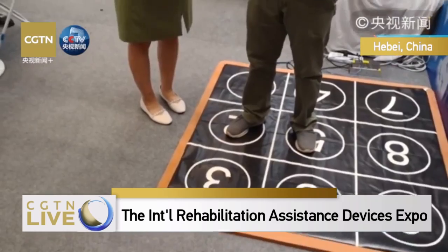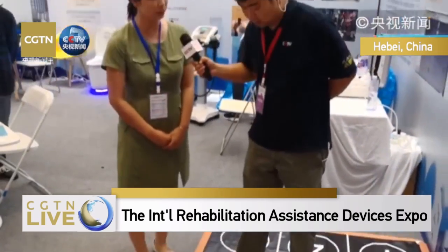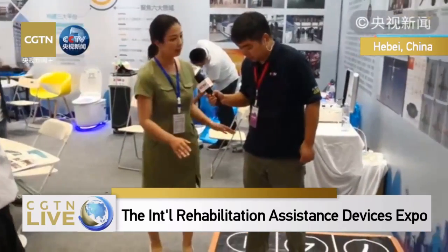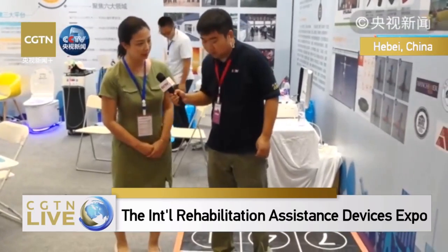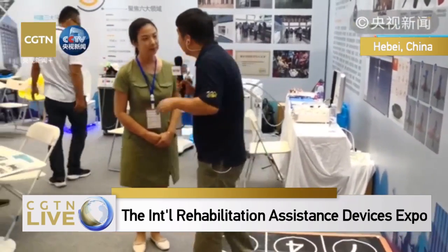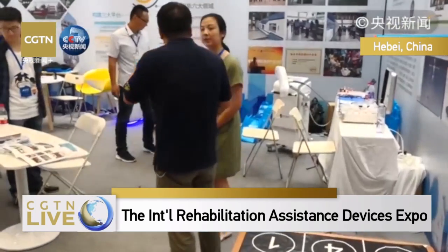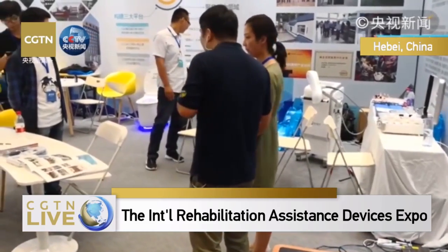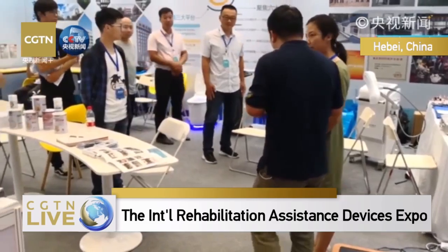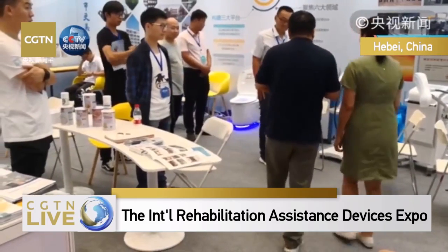I can tell you which part of your feet is withstanding the power in an uneven manner. At the same time, there are exercises to prevent elderly people from falling down. These are primary statistic analysis of an elderly citizen.